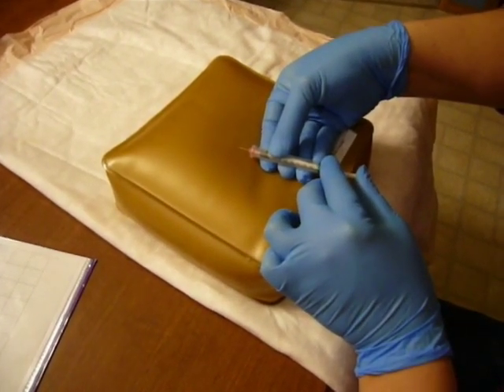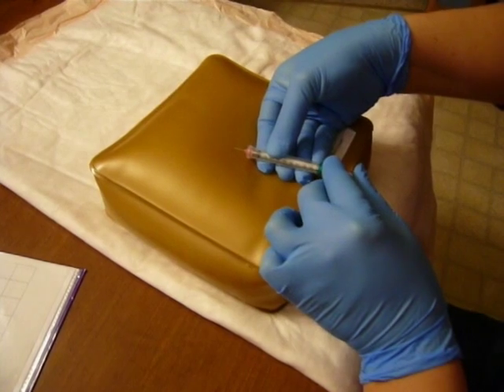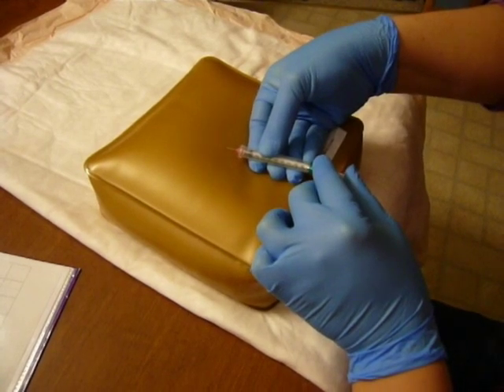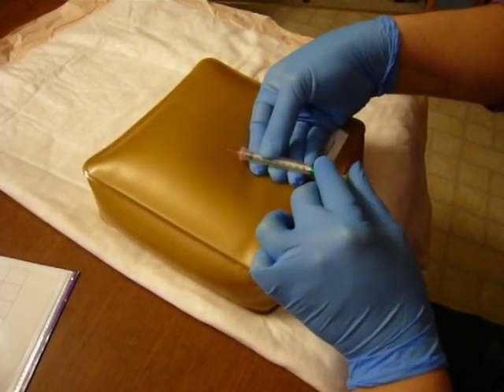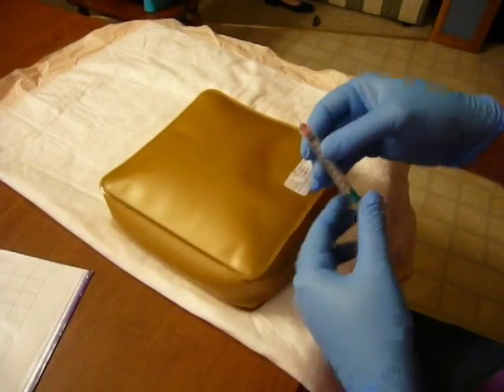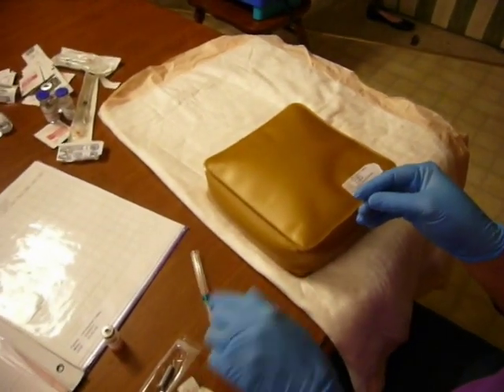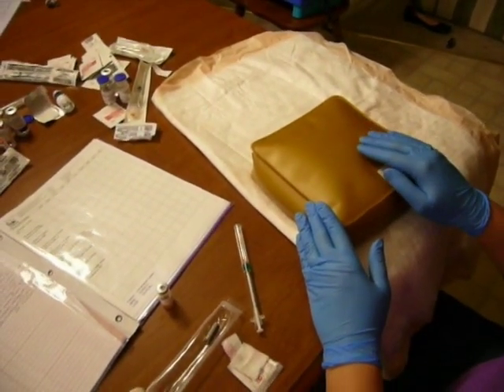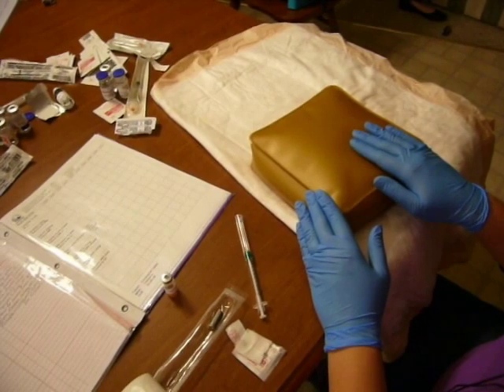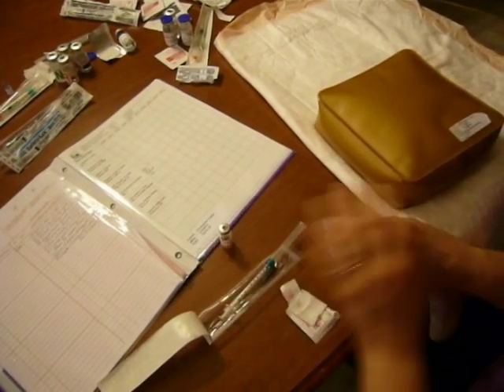I'm going to slowly inject over the course of three to five seconds. Now, during that time on a real patient, you'll see the formation of a bleb under the skin. If you don't see that, you need to stop and look and see where your needle is — you may be in too deep, or if it's leaking out of the skin, you won't be in far enough. Once you have the bleb formation, you're going to stabilize the skin and make sure that you come out of the skin at the same angle that you went in at. You immediately do needle safety by covering it, or whatever needle safety device there is. That goes back down, ready to go in the sharps container. Check your patient. Remember with these, you may not massage or rub the site because it will alter the absorption of the medication. Once you know your patient is okay, your needle goes in the sharps container, your gloves come off, you wash your hands, you document the procedure, and you leave the room.